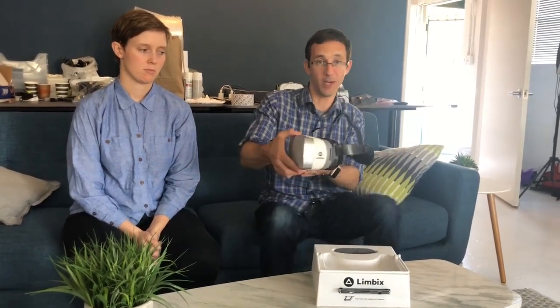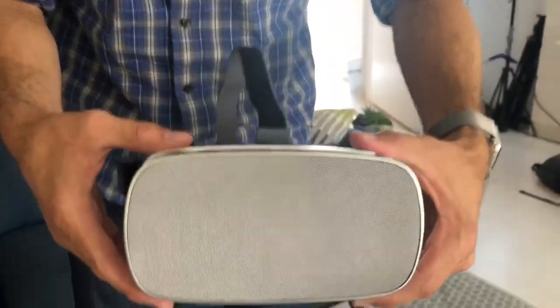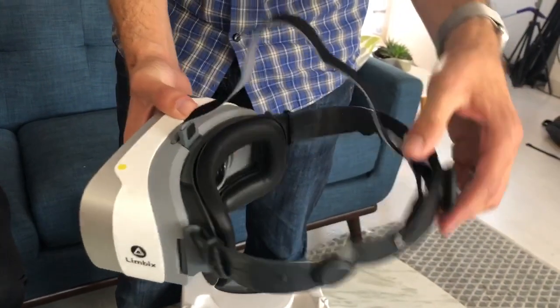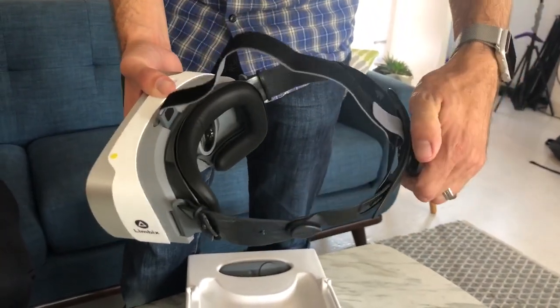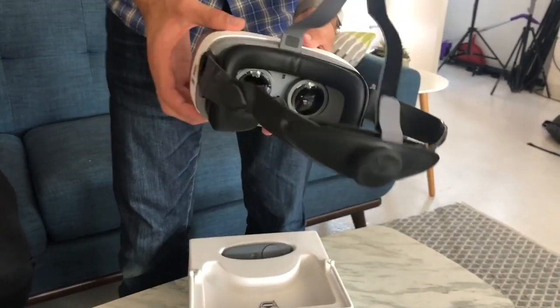So this is the Limbix headset. We want to get a close-up of the headset. Okay. And what we've done is customize the headset so that we have our own straps, which are fully wipeable with the alcohol wipes, and this ratchet system in the back. We also have a leather insert again to make it wipeable and therefore more hygienic.